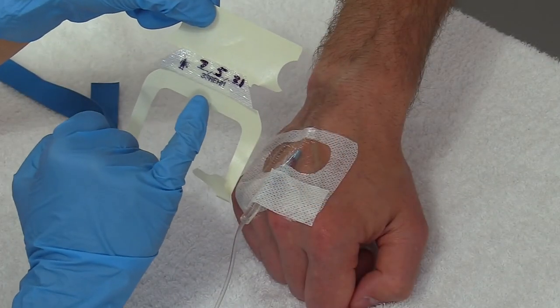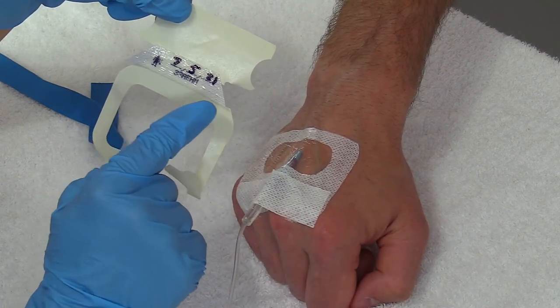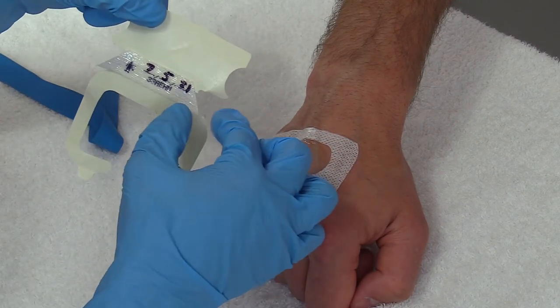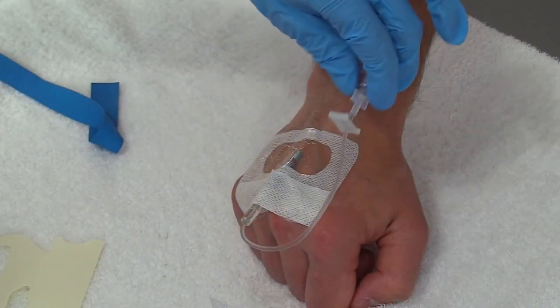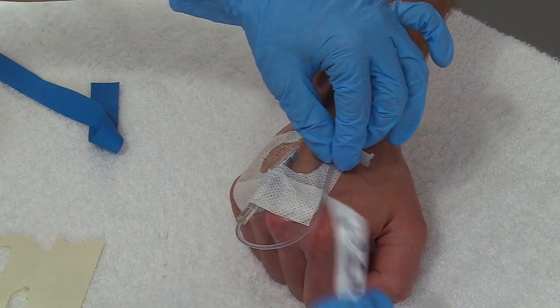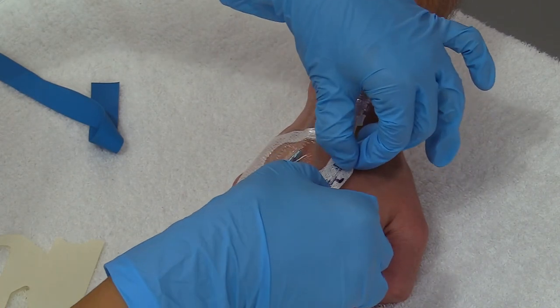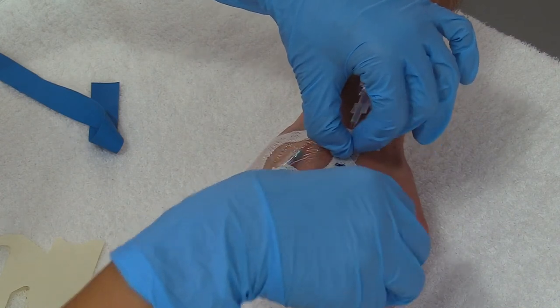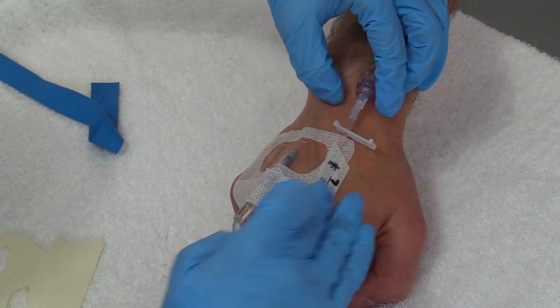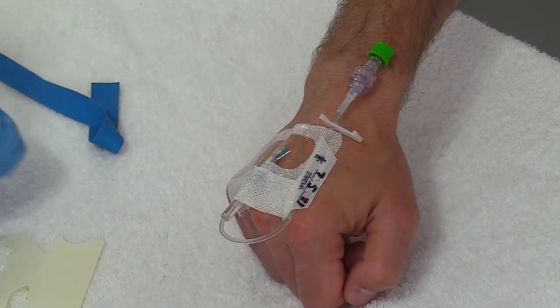There's another piece of tape to secure the tail of the IV. I've already filled it out — I've put the insertion date here. Put whatever date your facility requires. So I'm going to peel that off, put the tubing in the J shape again, lay that there, and slide this piece of tape on this part. Be sure you smooth the edges down so that it sticks, which will help protect the site and keep it more secure.